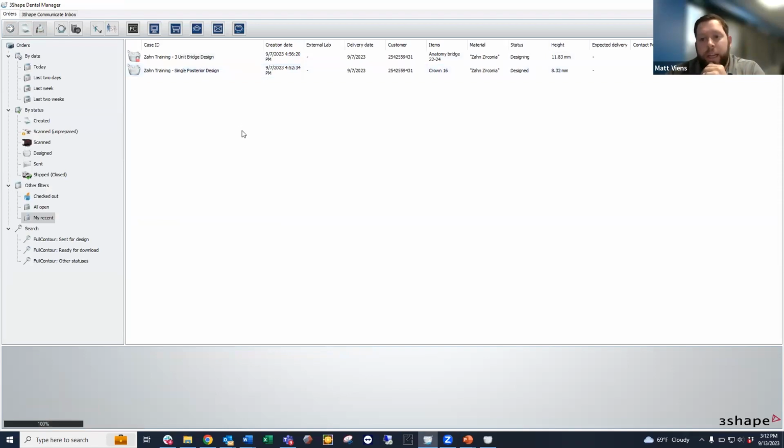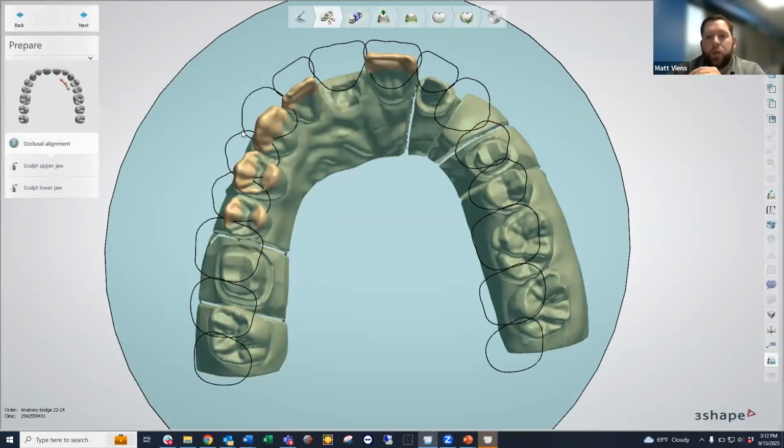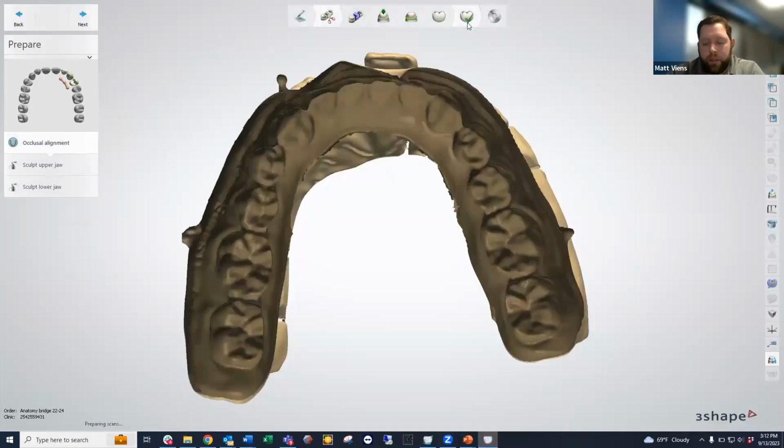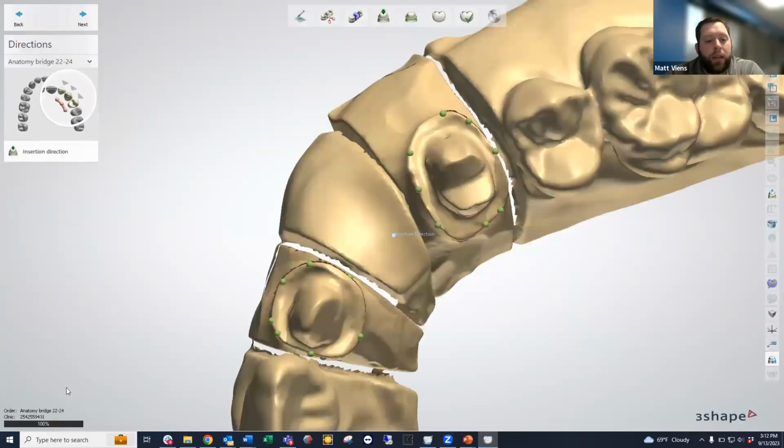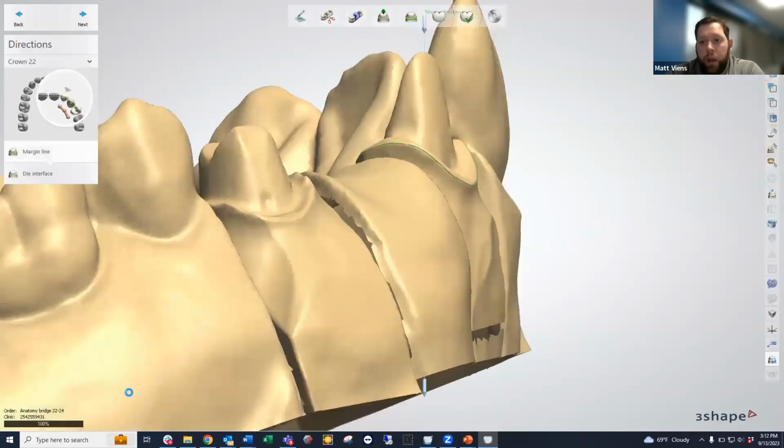So that's a great question. Checking the connectors to make sure that they're thick enough is very vital to ensuring that you have a successful bridge. I'm just pushing all the way through the major steps, and it's going to apply all the changes that I've done so far. The more clicks, the longer it's going to take to go through each of these individual stages. So being a little bit conservative with your clicks helps reduce the processing time and allows you to reach the final stage a little bit quicker.